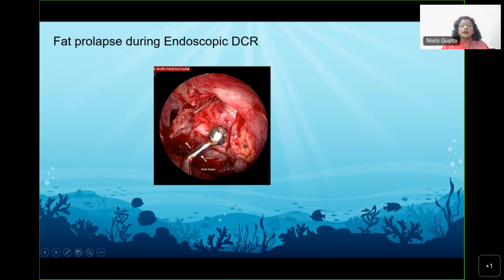So in that attempt, what happens is, if I can show you with my hands, if this sac is like this, and we have opened it like this, through this mid center portion, if we are clear about the anatomy of the lacrimal sac, how it lies in the inferior-medial quadrant of the skull, and beyond this is all lamina papyracea. So if we go into the junction, into the depth to take a biopsy or take out tissue, then we might pull a little bit of fat.